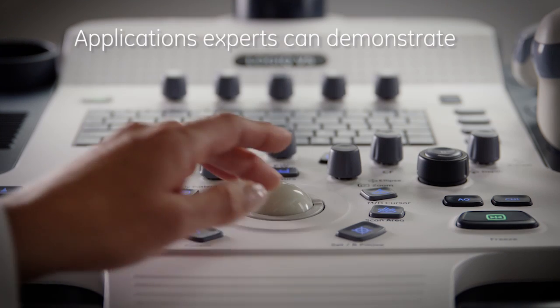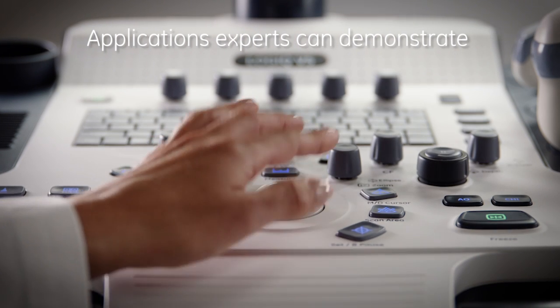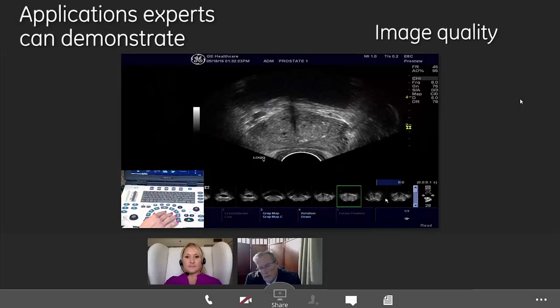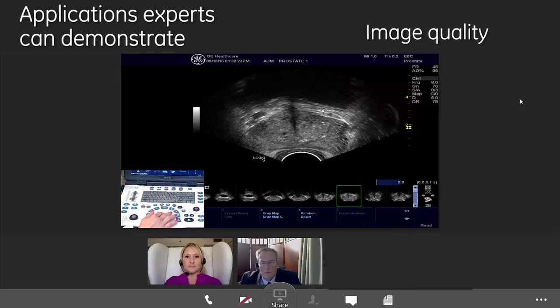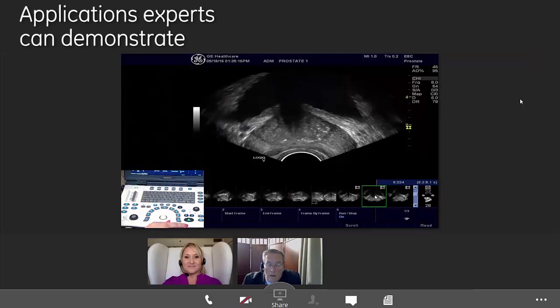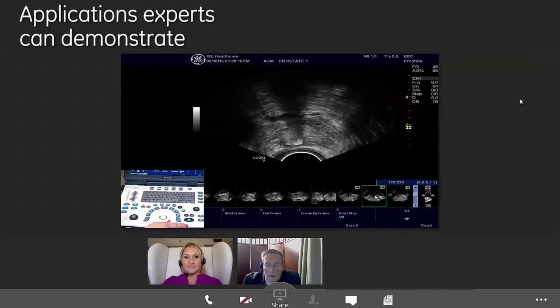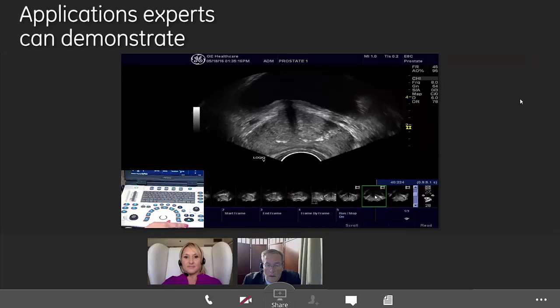During the online product introduction, the Application Specialist can demonstrate. As you take a look at this image, just remember to look at the image quality. Look at the image from top to bottom and see the detail that you're getting there. Here again just a cine loop, and we can see how we can tell the border definitions and tissue differentiation.